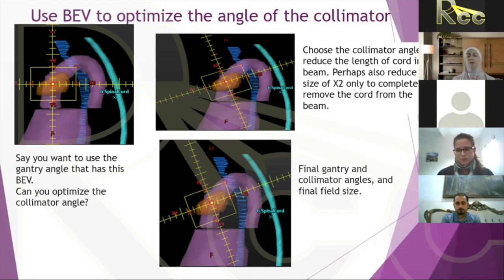And life is beautiful and everything is fine, okay? When I'm taking this decision, especially this one, you have to really think about, do I have good immobilization? Can I account for motion management? How good is my machine tolerance? And as I said, by the way, if I have 6, 7, or 8 beams, it is okay that some of the beams are seeing some of your organs at risk.